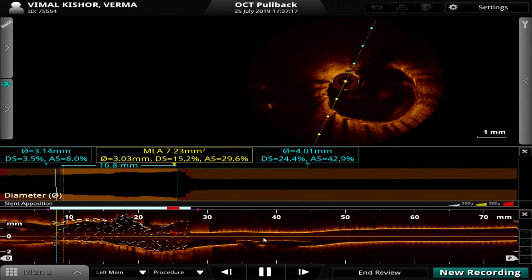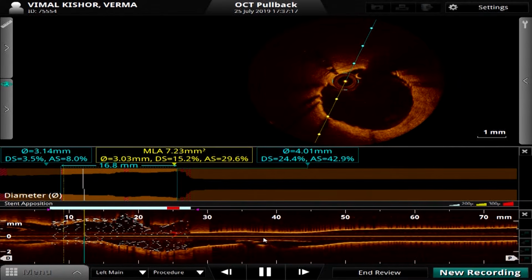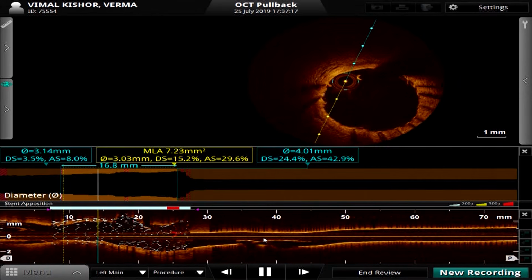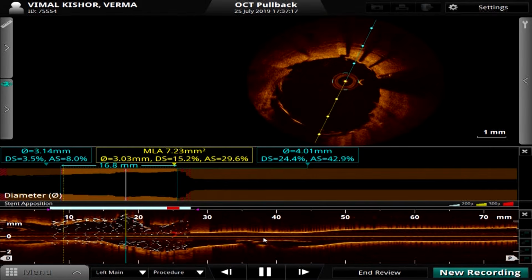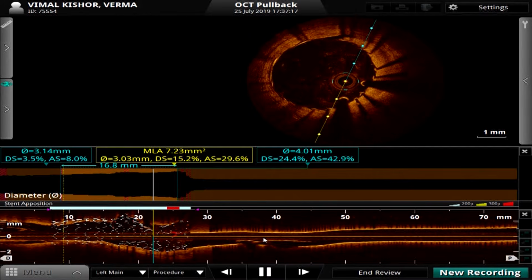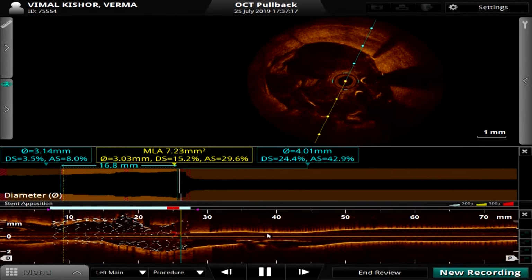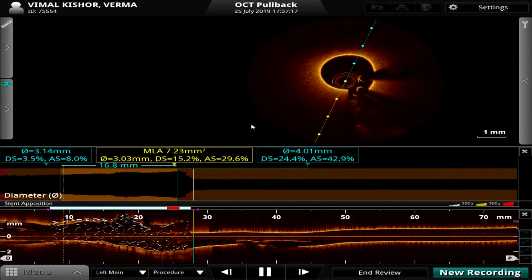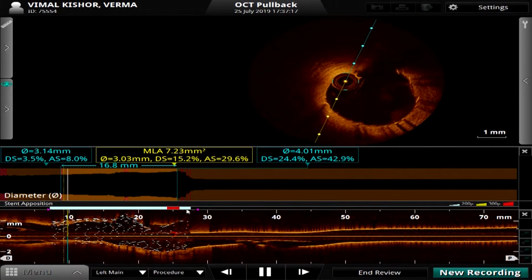Now directly it is going to guide, and that shows. Yeah, left main. You see the cuspogram, and you see again, still here there is a little overlap on the sinus and the vessel. Can you make that out? Because this is a LAO caudal view. Some people consider LAO caudal as good for ostium, but this is what I teach all the time. That's what we discussed. Cranial is always preferable for ostium.